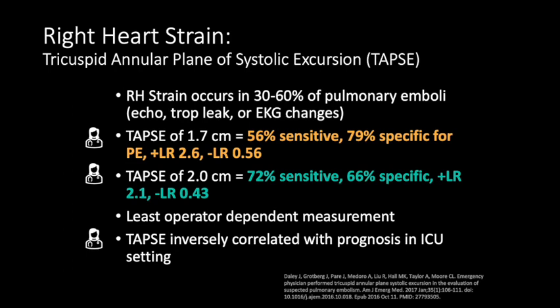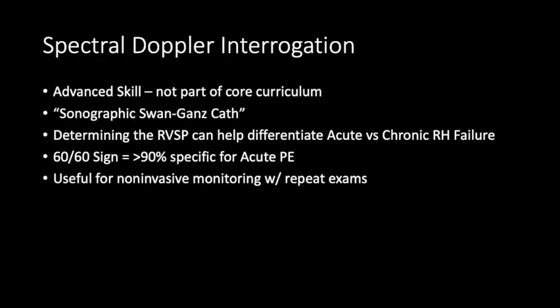It's also the least operator-dependent measurement, meaning that it's the least subjective and most objective measurement that we take, which gives us some pretty good reproducibility.